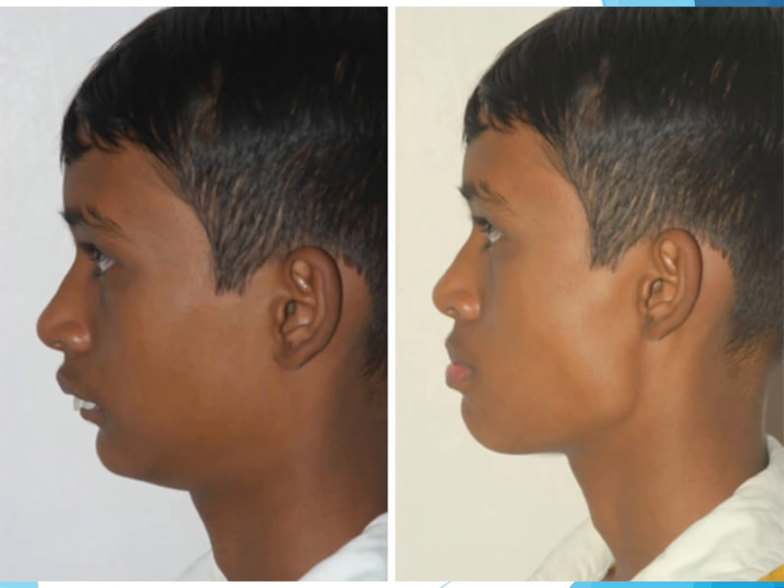So for this photo, we can see that on the left side, the patient's mandible is backward, and then the right photo shows that we ask the patient to posture the mandible forward. We can see that the profile is improved. So in this patient, functional appliance therapy is good to improve the profile.